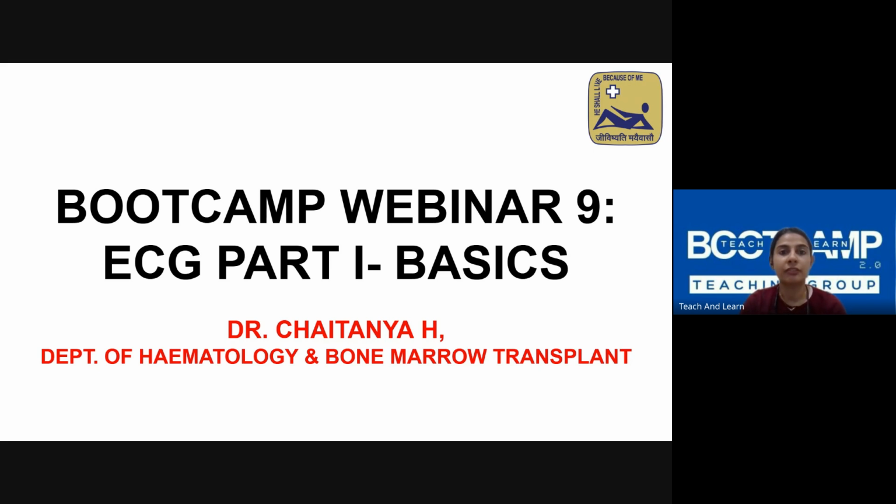Today, we'll be having the first session on ECG. So this time ECG class has been divided into two, part one and part two. This part one class will cover the basics of reading an ECG.